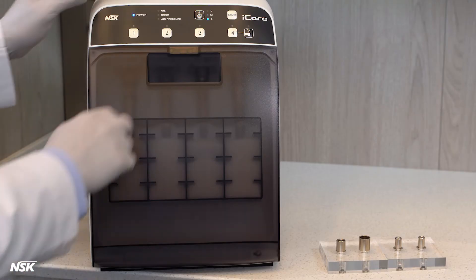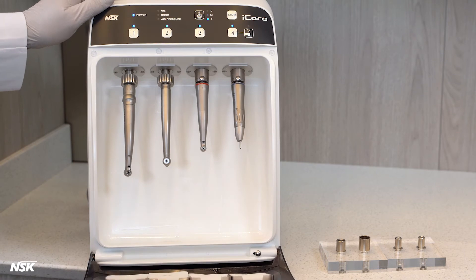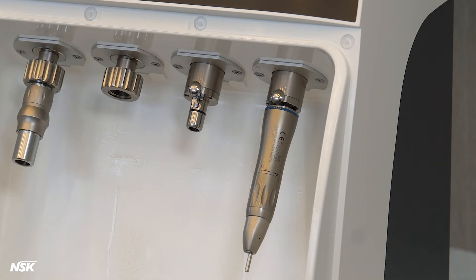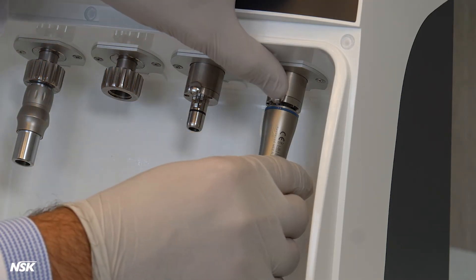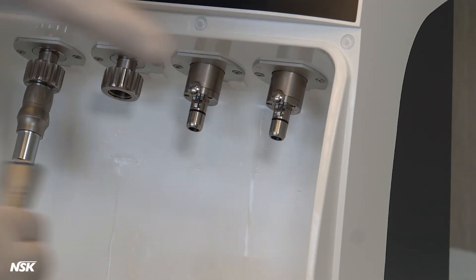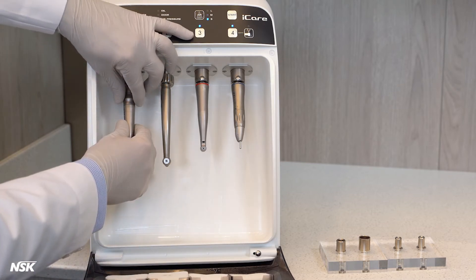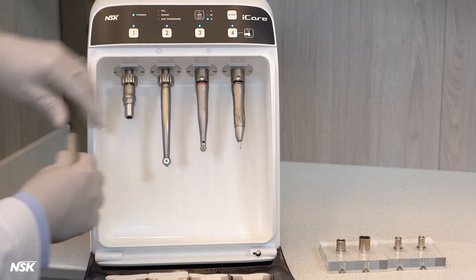It is now safe to open the front door, take out the handpieces, and prepare for bagging and autoclaving. For E-type handpieces, press the lock button with one hand and pull the handpiece with the other. Unscrew the direct connect air-driven handpiece, and use both hands to pull back the PTL adapter sleeve and pull out the high-speed coupler type handpiece.